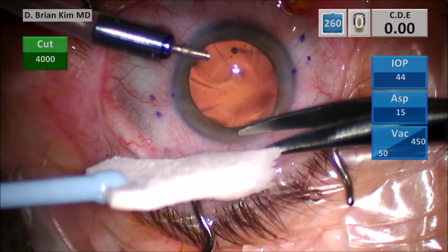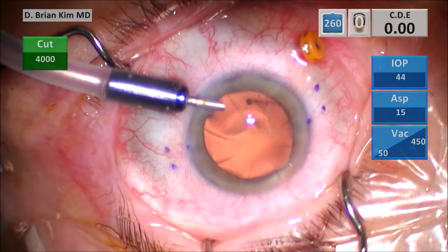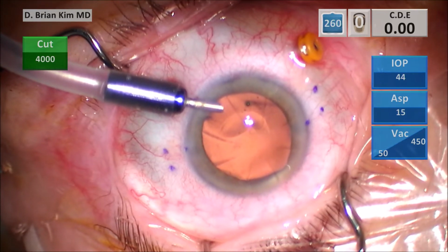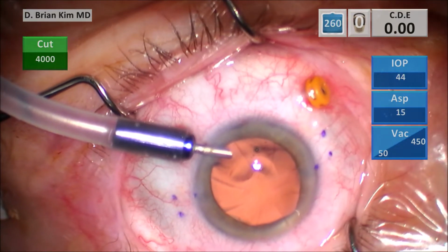It's always a fine line when you're dealing with these cases. I firmly believe when you have a dislocated lens, the vitreous in the anterior segment is very, very liquid, and so it's a very low risk for causing any problems. But nonetheless, you want to manage it and deal with it.